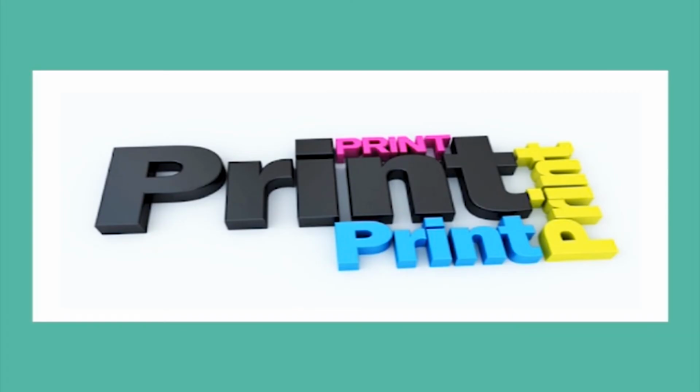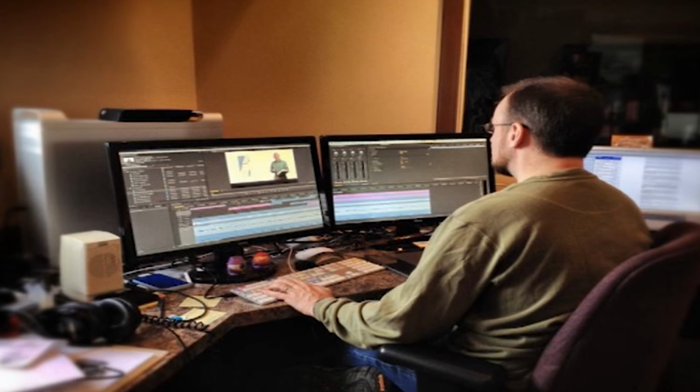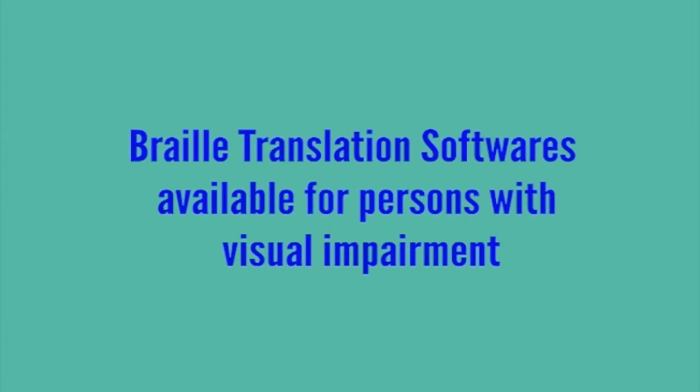There are a number of software programs available for translating Braille into print and print into Braille. Braille translation software converts documents or other forms of digital text into a Braille form. These software systems may differ in editing capabilities and system compatibility. We can receive the product's features from the vendors. Now let us see an array of Braille translation software available for persons with visual impairment.